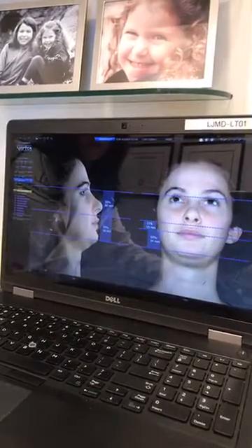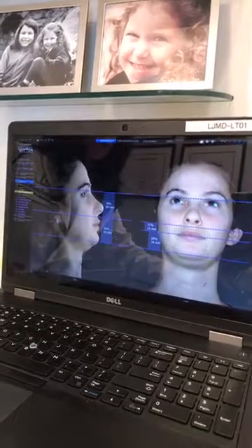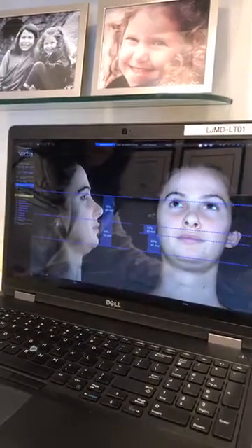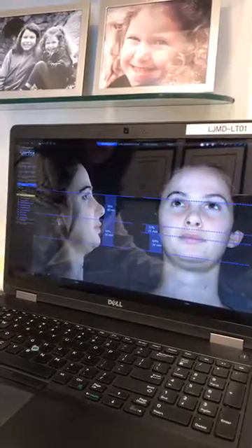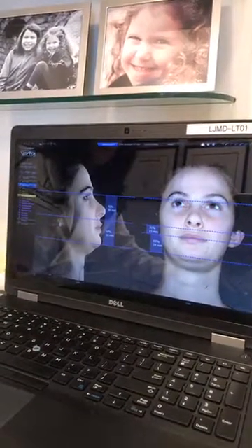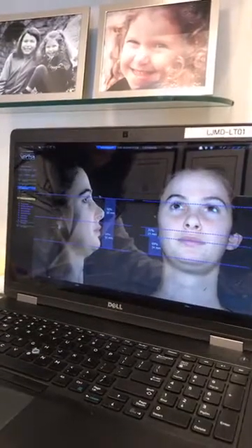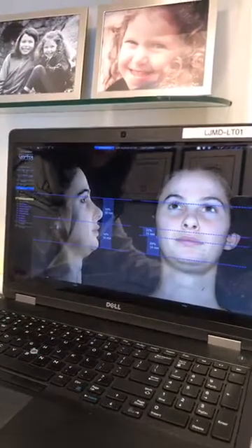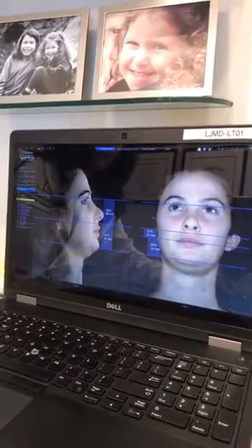Another really important thing to look at is the proportion of the face. In this horizontal projection, we like to break the face up into thirds. This program is showing us, and these are ideal proportions, Kristen, just so you know, that the middle third and the lower third of her face are exactly the same, which is perfect.